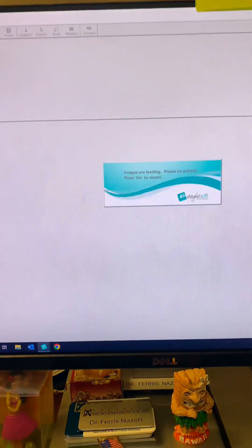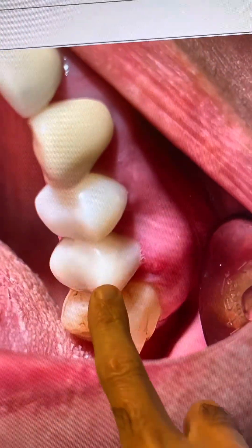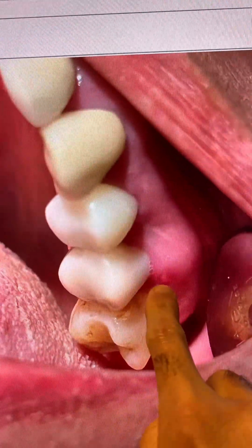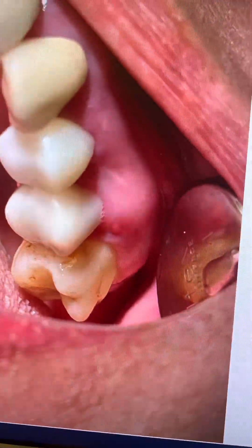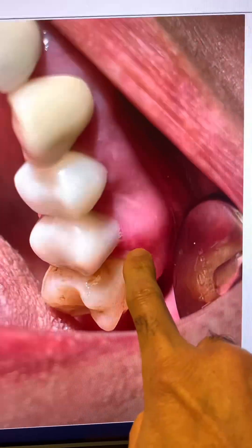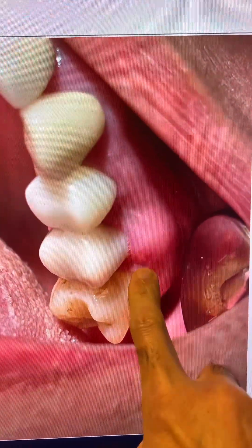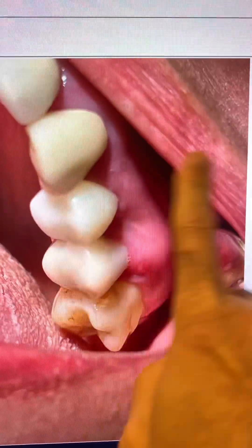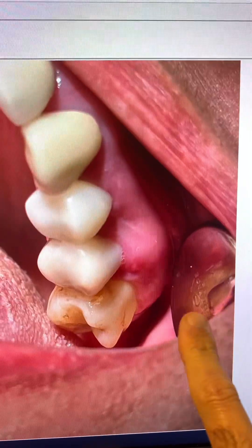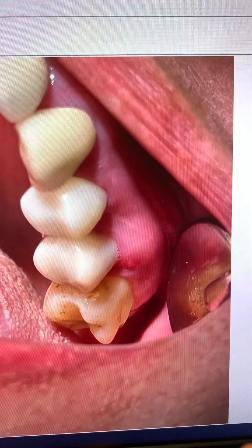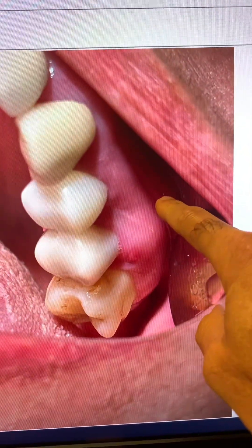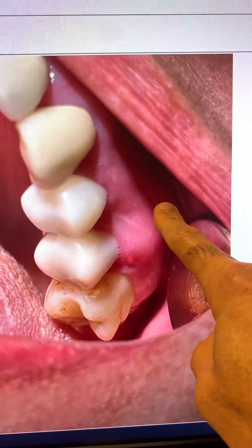There was a buccal parulis and sinus tract associated with the tooth. Let me show you. That's the tooth here, as you can see. And take a look — that's the buccal parulis and sinus tract. I want you to pay attention to where this is. You can see the location of this sinus tract right here. Usually if there's a sinus tract associated with a tooth with or without a previous root canal where there's an infection, you find the sinus tract more superiorly.